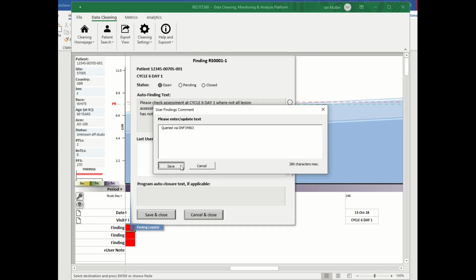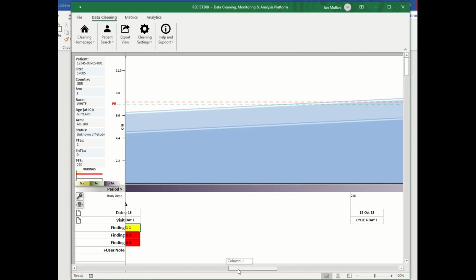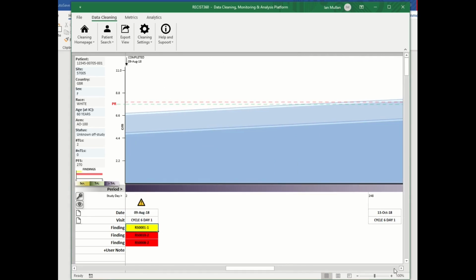It is likely you already have lesion and response data review methods in place. And of course, some may argue this is a duplication of effort. But I am sure you can see, this is far more efficient, less error-prone and without undue duplication in the long term.